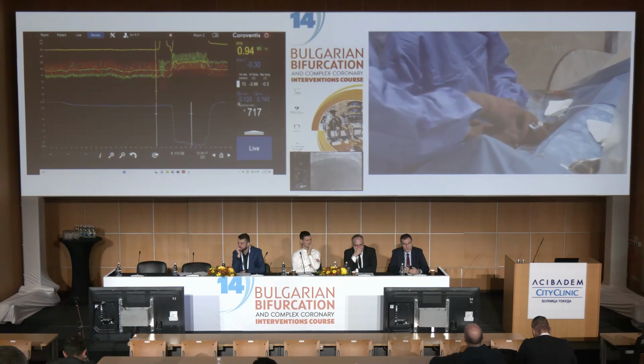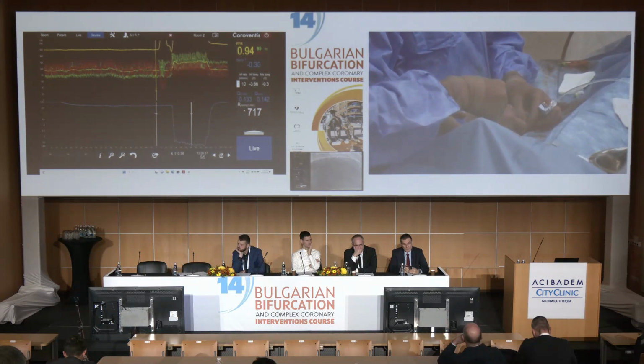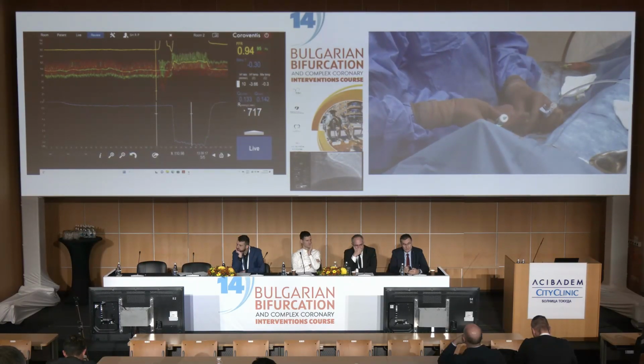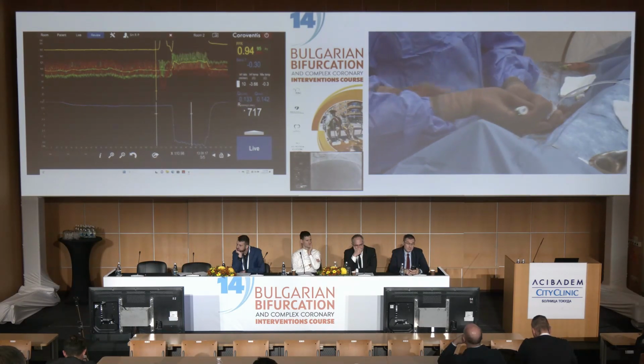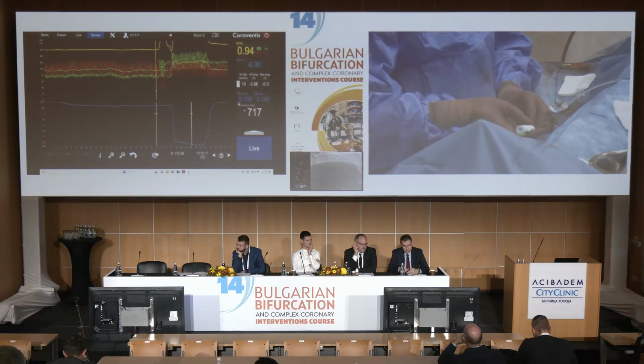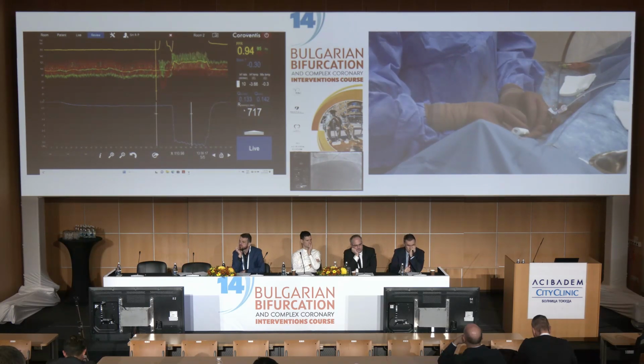We are going to switch again. So advance the wire please in the distal part of the vessel. Yeah, okay. There we go. Test a bit. Please don't move the catheter because it's important to remain at the same position. Okay, a little bit of test. Okay, you see it's a huge vessel.